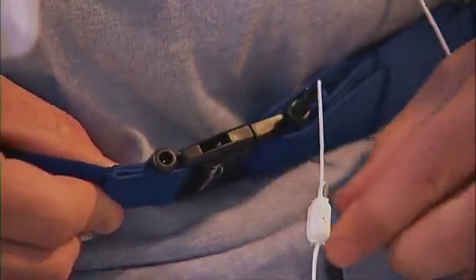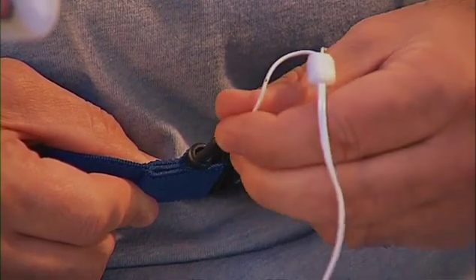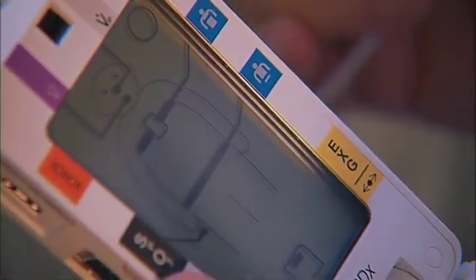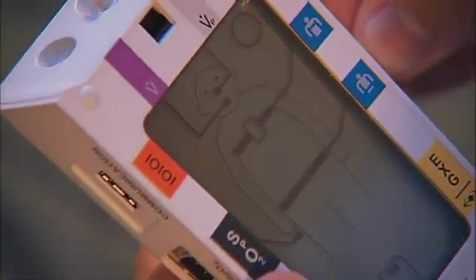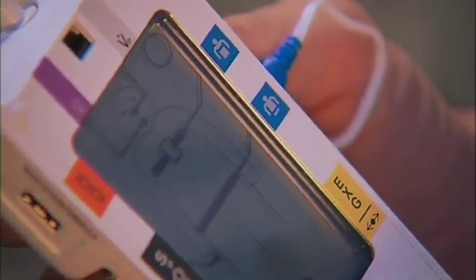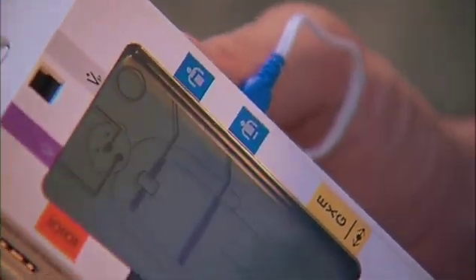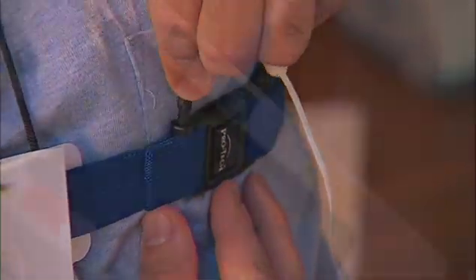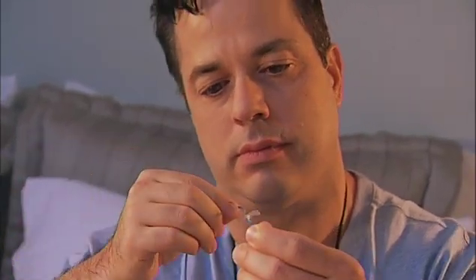Insert the two ends of the abdominal belt wires into the ports on the abdominal belt, then insert the blue connector into the lower blue port on the device. As each sensor is connected, the corresponding display will stop blinking to indicate that you have made the connection correctly. Now connect the two ends of the chest belt wires into the ports on the chest belt, then insert that blue connector into the upper blue port of the device.